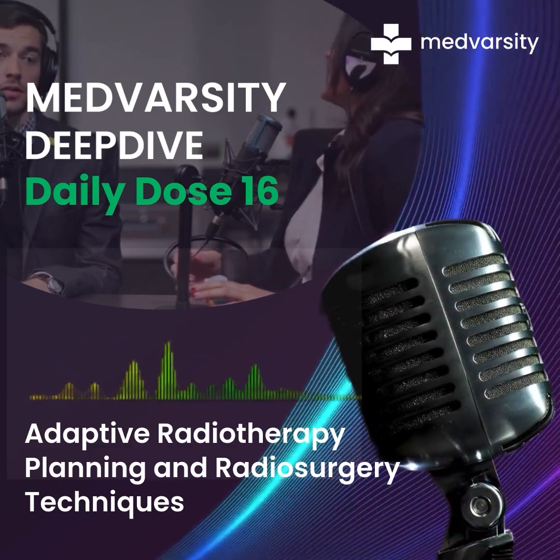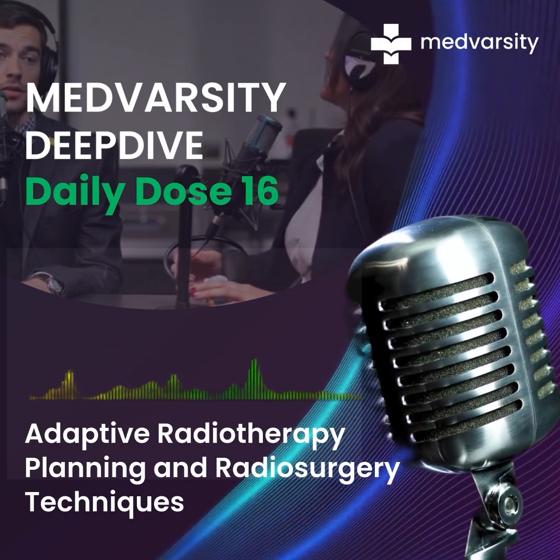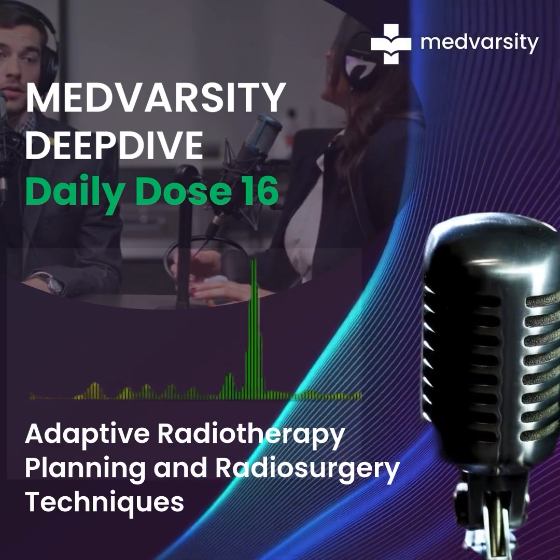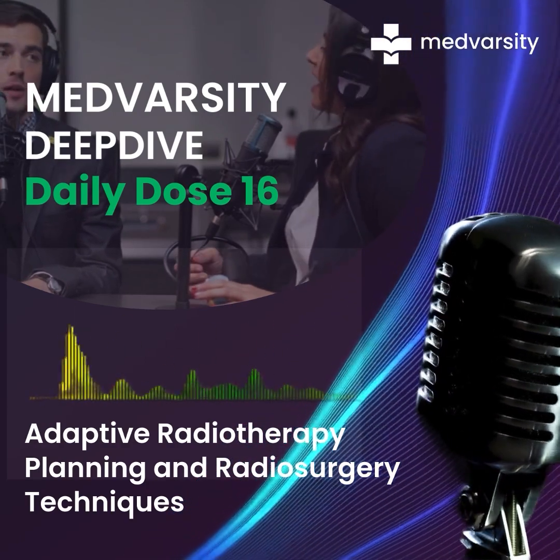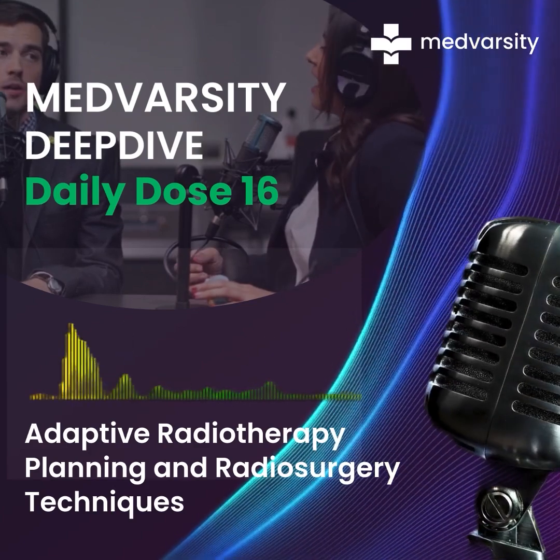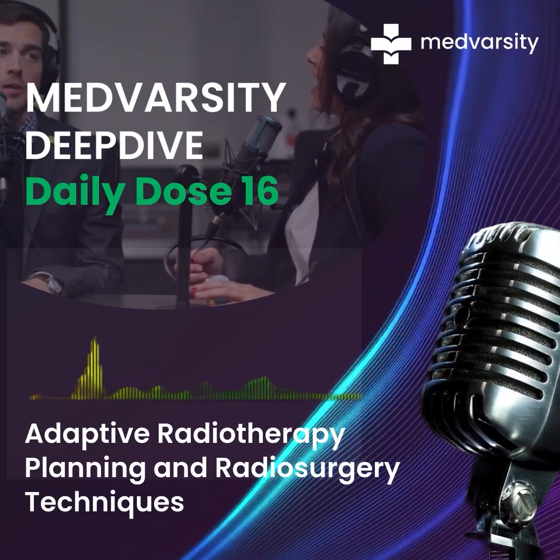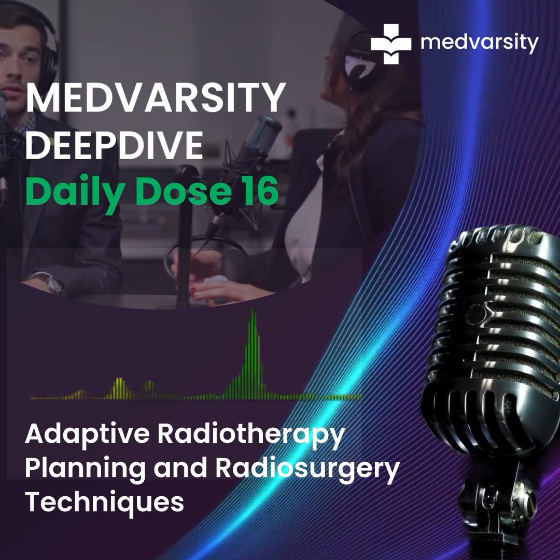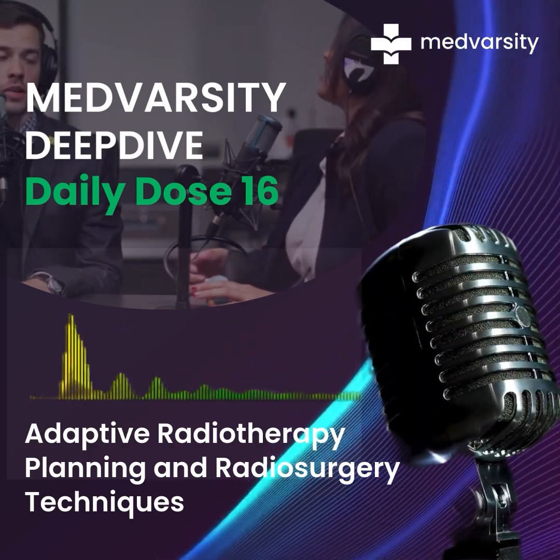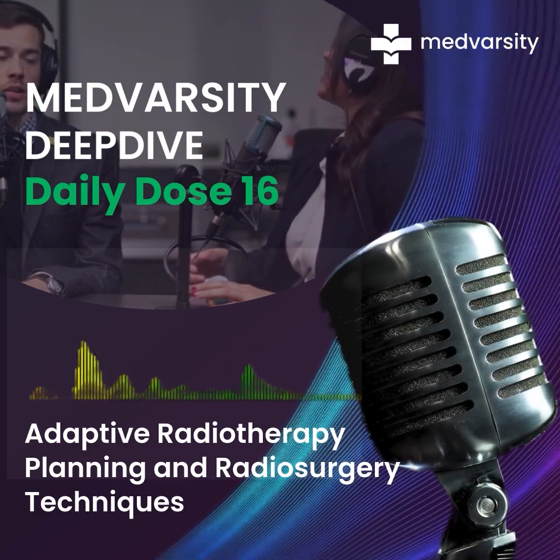But what we're going to talk about today is how this is getting even better with the idea of adaptive radiotherapy. It's like having a treatment plan that can change in real time, adapting to changes within the body as the tumor shrinks or the patient's anatomy shifts. Imagine you've got a treatment plan, but as you're going along, the target starts moving. Without adaptation, you're essentially shooting in the dark. But with adaptive radiotherapy, the plan recalibrates itself to make sure you're always hitting the bullseye.